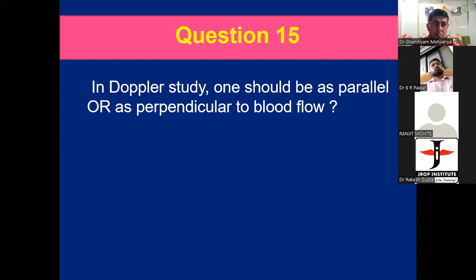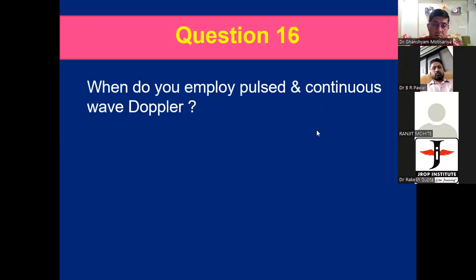Dr. Sai Prasad, good evening. Question for you: when do you employ pulse wave and continuous wave Doppler?